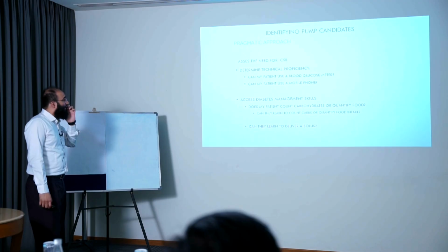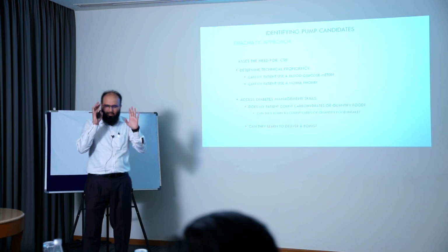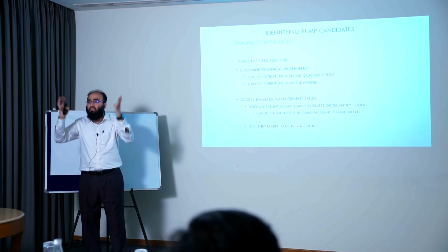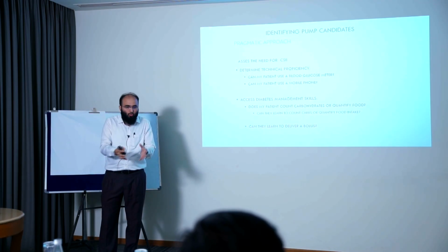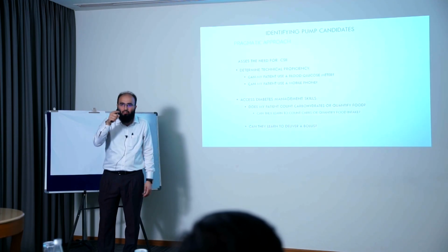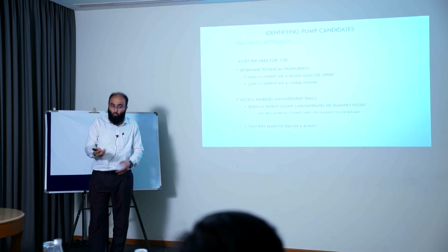And the pragmatic approach is, first, if you have to identify a pump candidate, assess the need for CSII. Is the pump really needed and is it really going to create a phenomenal difference in the life of this patient if he is put on the pump? What is it, in addition to what he already is doing, that this pump therapy is going to offer this patient? That should be the question you ask yourself. Will my patient benefit? Is that investment going to offer value beyond what he is already getting?